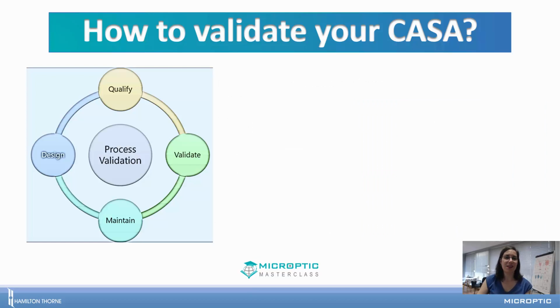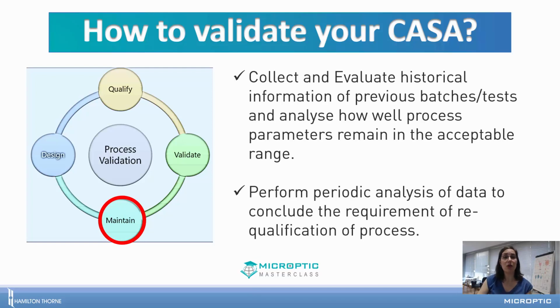Unfortunately, this is not the end of the story, because once you have validated the system and introduced it in your routine, it's important to give evidence that the system is working as expected with the passage of time, that it is complying with all the requirements you specified in your validation protocol.